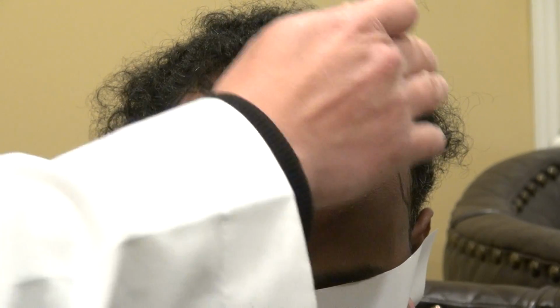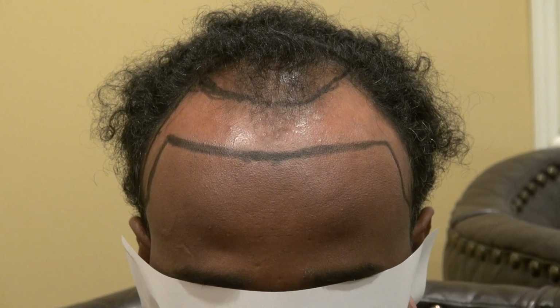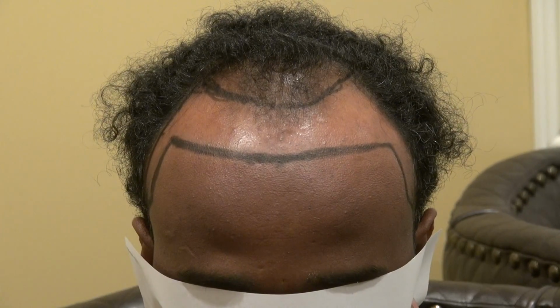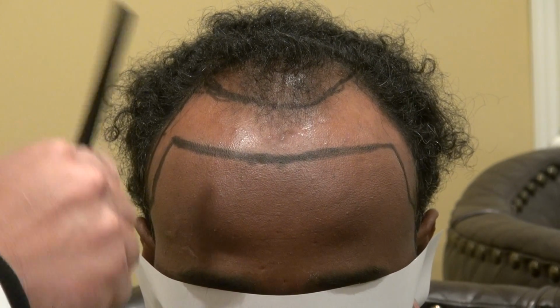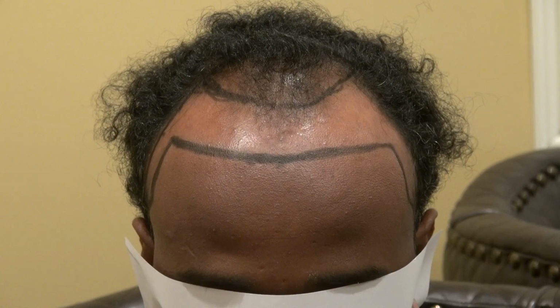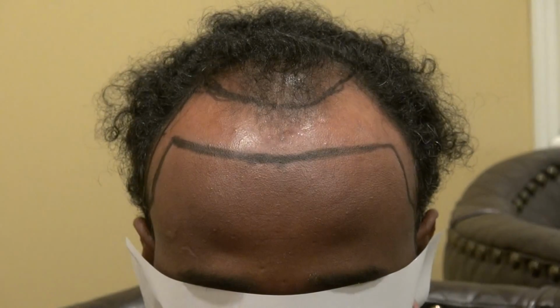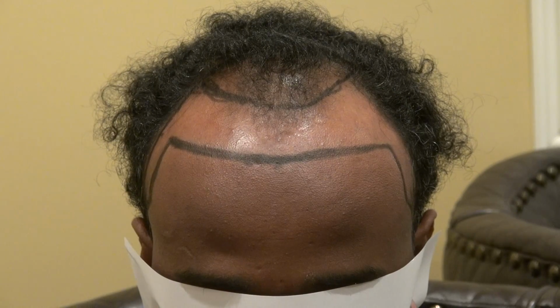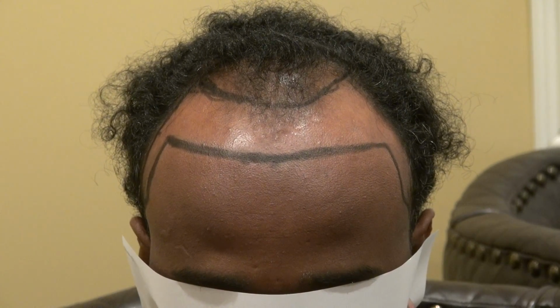And then once we get the shape down, I'm very precise when I do the hairline drawing, because you want to make sure both sides are even, and make sure when you bring in the temple it is even as well. For black men, the zigzag is smaller in amplitude. Why? Most black men like to line up the hairline anyway. For Asian and Caucasian, we have a bigger amplitude because we really don't line our hair up.